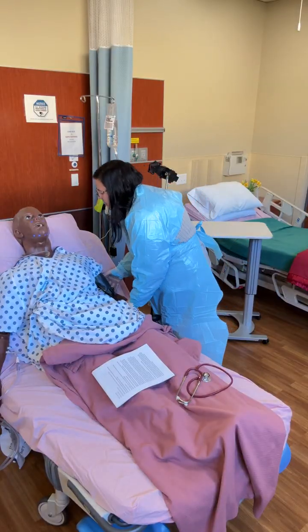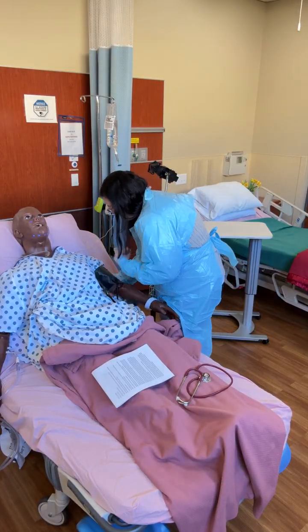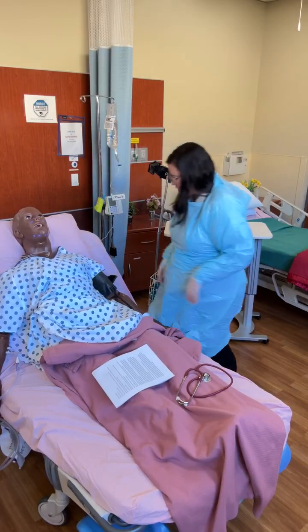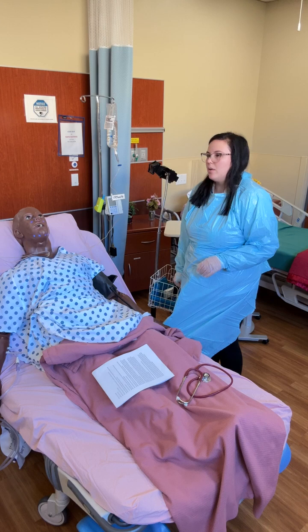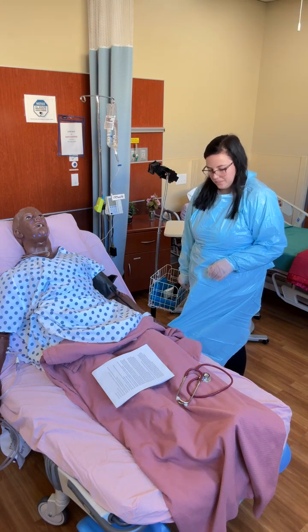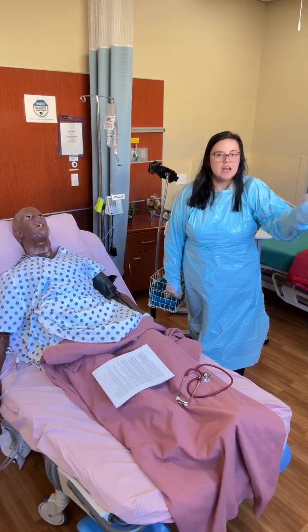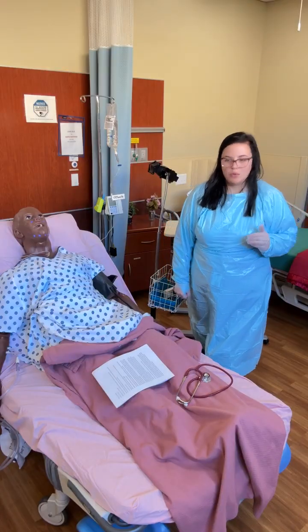All right, Stan, I'm just going to get a blood pressure from you here really quick. All right, my blood pressure cuff is on. Sim question, what is my blood pressure? Blood pressure is 128/88. Perfect, 128/88. And so my partner is going to write that on the board for me.